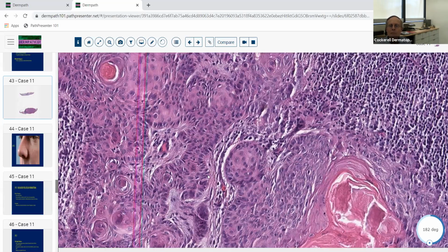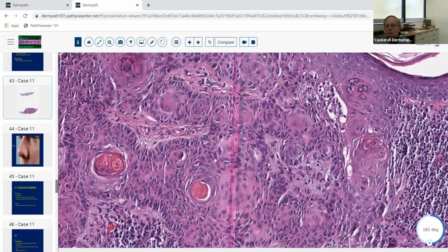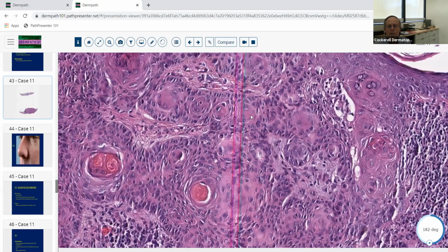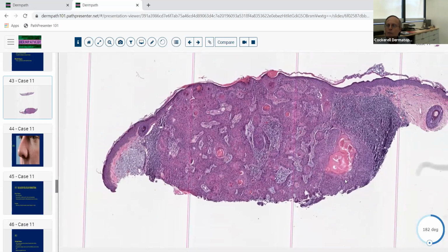We've got, once again, some small squamous areas here undergoing cornification. We don't have any atypical cells, no mitotic figures, no acantholysis, none of those things we saw before. So this is also exhibiting a different portion of the follicle. This is probably at the lower part of the infundibulum and right around the upper part of the isthmus, and maybe the mantle zone is being recapitulated here. So this is a benign lesion. It's also follicular.